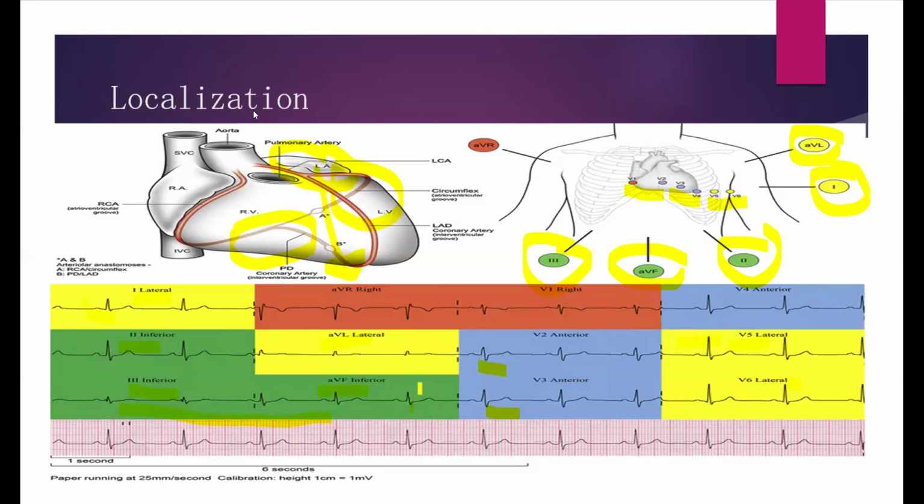Hello, I have a question. Maybe a clarification about STEMI. I want you to clarify for me about the contiguous leads, because somewhere I read that you have to get it in at least 2 contiguous leads. Maybe you can give us an example and clarify about the contiguous leads.